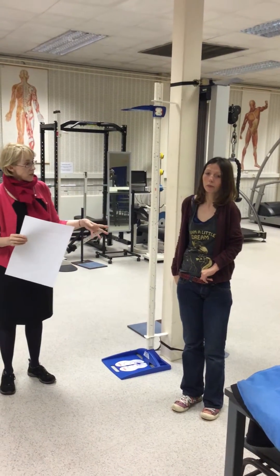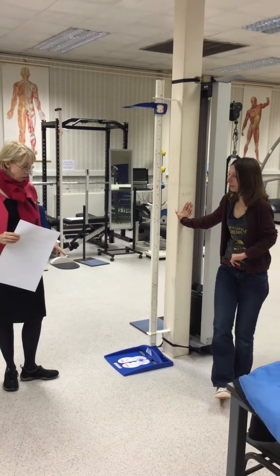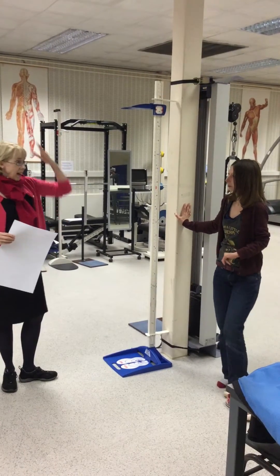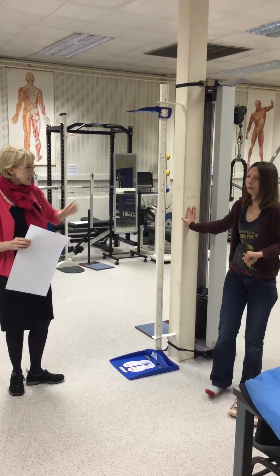Measuring height. The first thing we're going to do is ask the subject to remove their shoes. They can keep their socks on. If they have their hair on top of their head or are wearing a hat, we'd ask them to take that off, but Lee's fine.